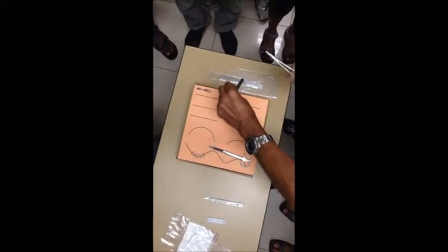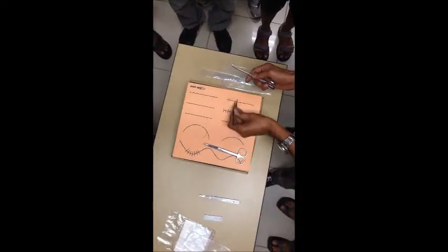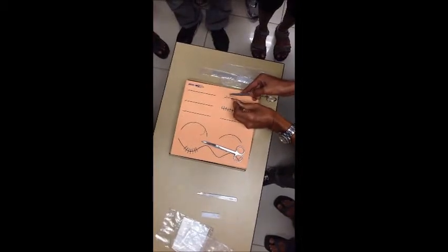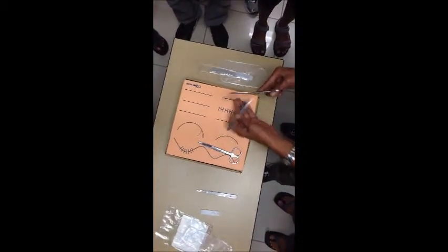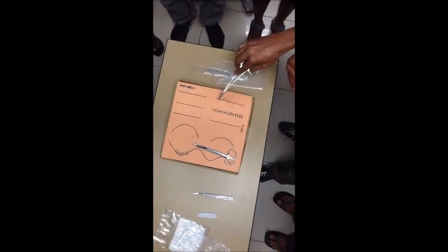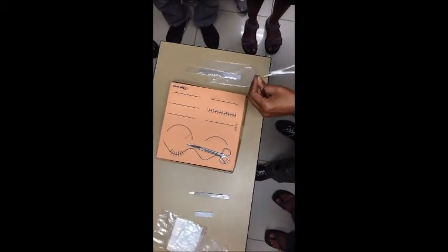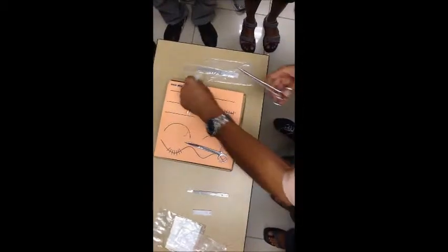The assistant has to keep giving traction, otherwise this will tend to become loose. Next, I'll continue with the procedure. Take another bite and take the next bite. See, things will now start coming obliquely. Just keep following. The assistant is giving constant traction here.